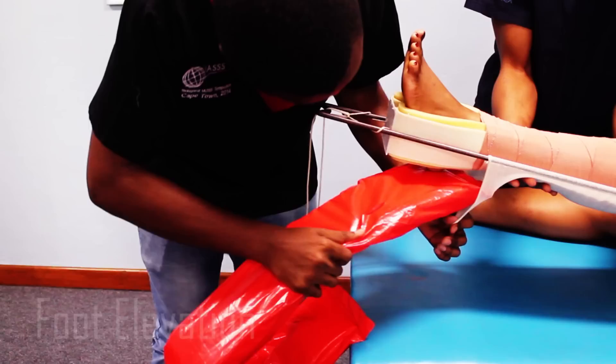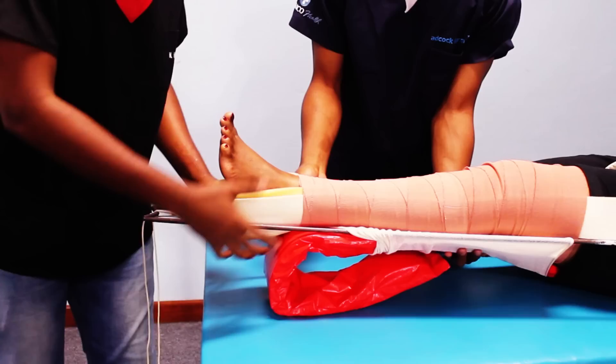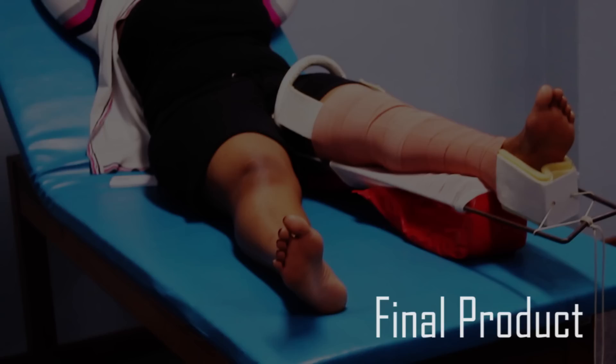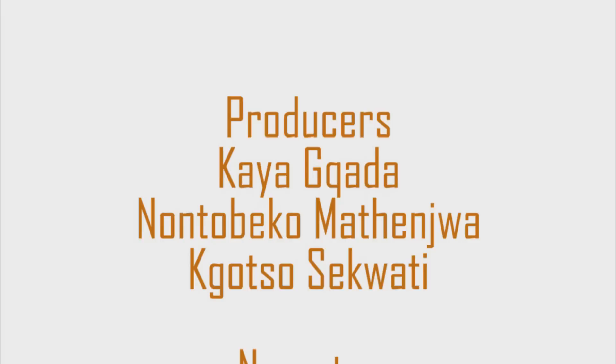The last step is to elevate the patient's leg using a crema wire splint or a pillow to prevent the formation of pressure sores. At the end, make sure that the heel is free. This is a completed Thomas splint. Remember to regularly check your patient's neurovascular status to prevent the development of compartment syndrome. Remember that a Thomas splint is temporary and surgery is the ultimate treatment.